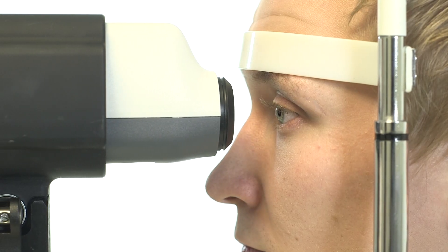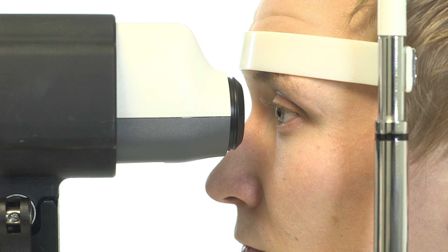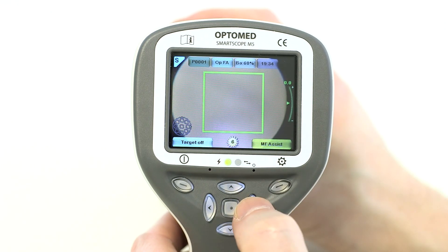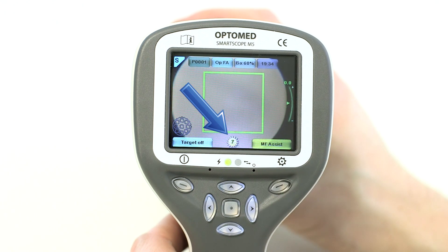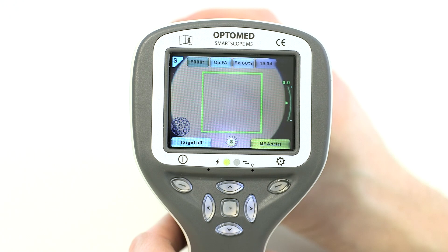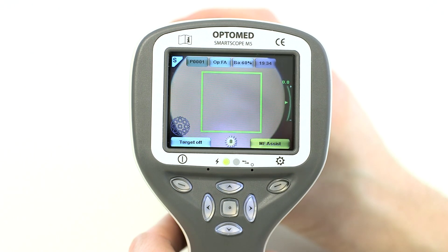Infrared and blue light is used during the capture. Select the right illumination level by pressing the left and right arrow keys. There are altogether 10 brightness levels with a default value of 5. The suitable illumination level for most people is from 6 to 8.